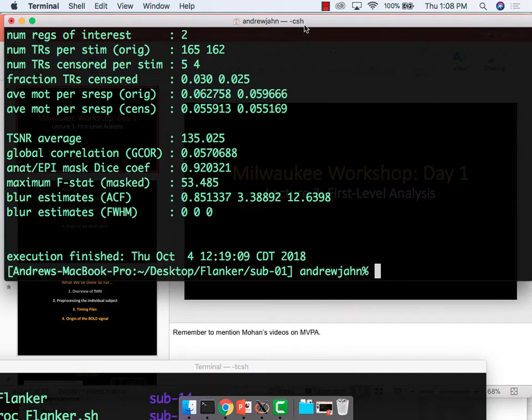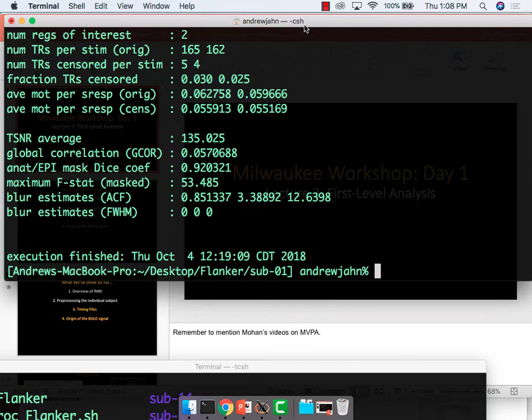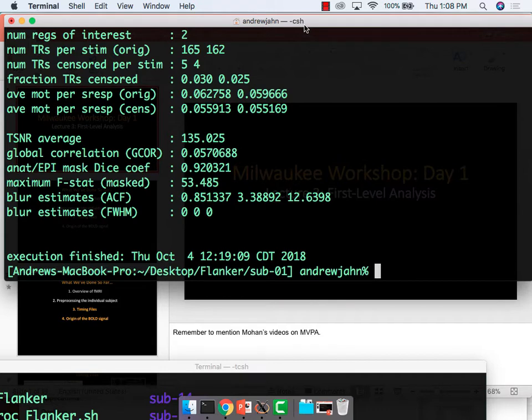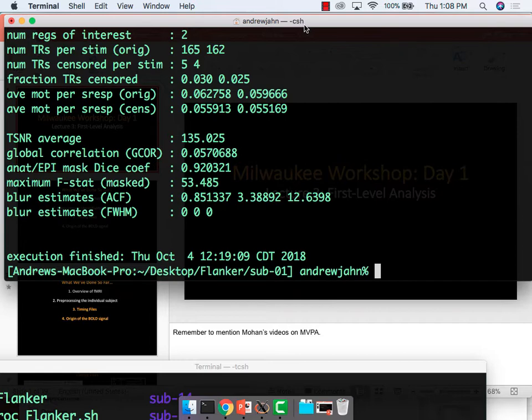So, for example, it removed TRs if it had to. It did things like slice time correction, motion correction, normalization, registration. It also ran through a first-level analysis, which is the focus of this next module. But before we move on to that, let's take a look at the processed data. Take a look before and after each step to get a sense of whether it looks right or not. So you should see something like this. This is some output that AFNI gives as a summary for different quality checks. We're not going to go over all of them.